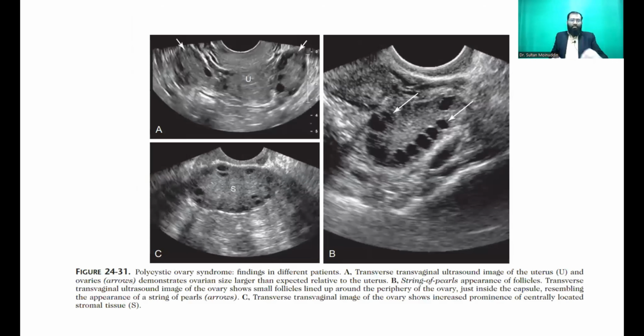Okay, so now let us start with this. What do you think? What is the finding which I am showing you? Very good, Razida. So this is classic. Very good, Rashmi, Fauzia. Everyone has answered it correctly. This is one of the very common pathologies encountered in our practice.